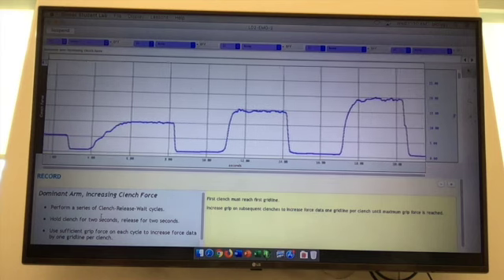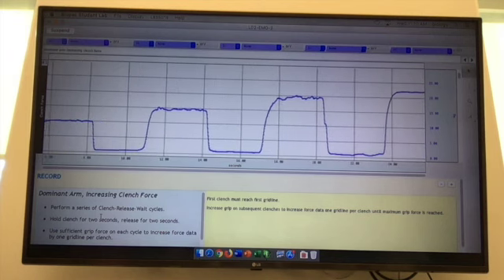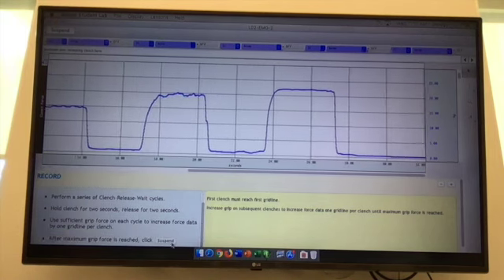And the screen follows you as you go throughout the exercise, so you don't lose any of your data. It just continues to record, and they go up as much as they can. That's my max. And so whenever they hit their maximum, then you can hit suspend.